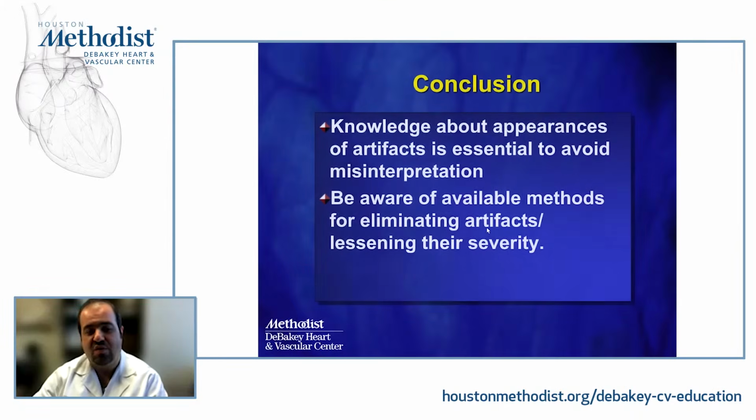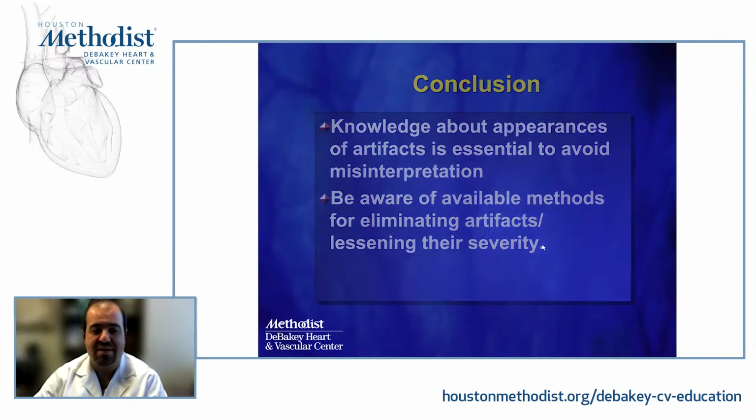So with that, I really would like to emphasize the take-home message that the knowledge about the appearances of artifacts is really essential to avoid misinterpretation and be aware of the available methods for lessening the severity of these artifacts, or even better, eliminating them.